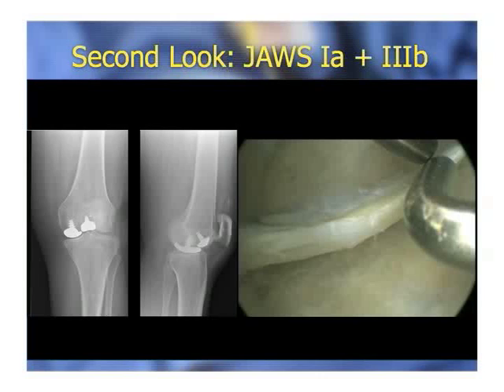And we did the injections, they helped, and then it would come back. And so we ended up scoping her again. And you can see kind of the same stuff that we noticed with the earlier studies.